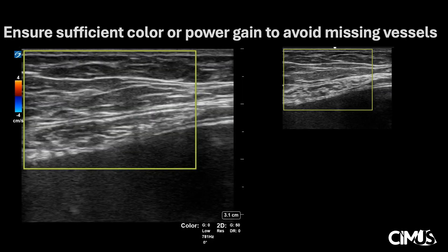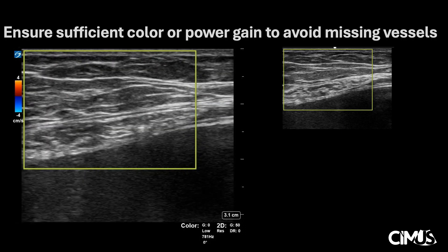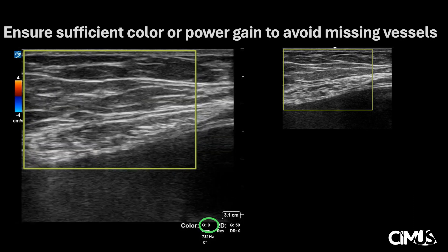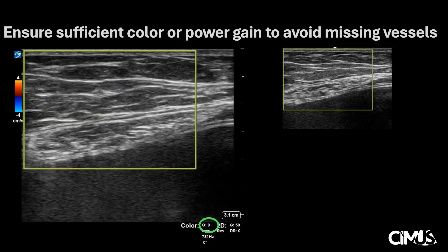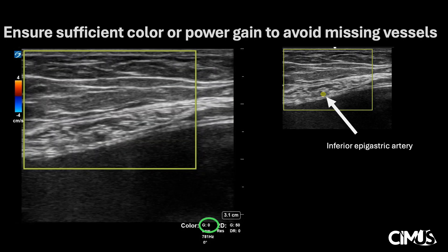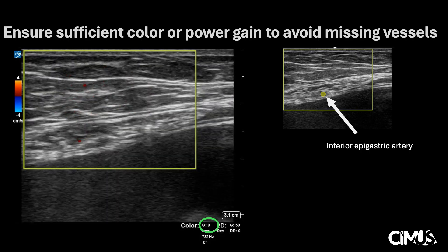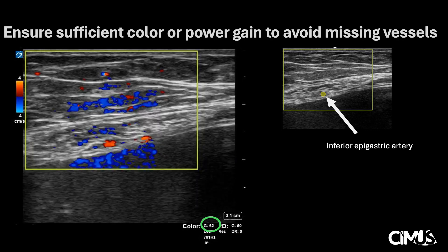Having insufficient color or power gain may miss vessels. On the left, you may think that there are no vessels in this area. However, this is due to our gain settings being low and the machine is thus not picking up adequate signal. Here on the right, we point out where there is in fact an artery that was missed. It is important to note that the vessels were missed even despite having a low velocity setting, which normally picks up very low-flow vessels. By increasing gain, the vessel is now visualized. It is therefore important to ensure not only adequate velocity or scale, but also sufficient gain to avoid missing vessels.